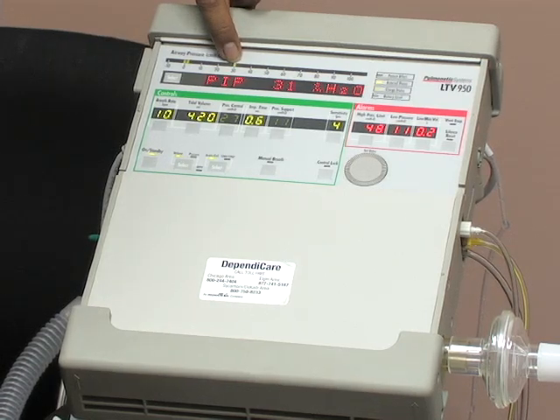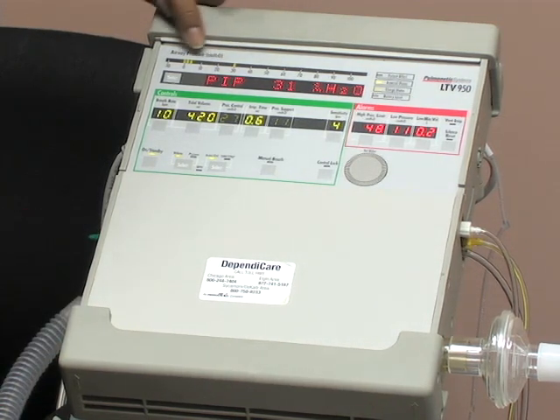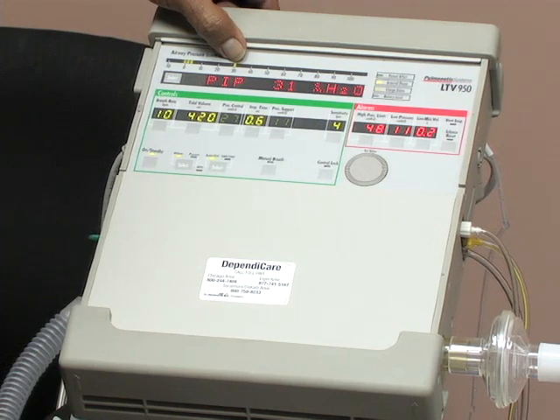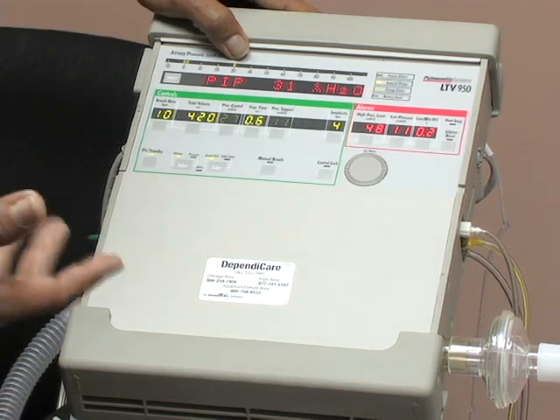As you can see, it says right about 30, and each time, every breath it changes. So whether you're scrolling or not, you can always see what your PIP is, your peak inspiratory pressure, at any moment or on any breath by looking at your graph. It's a very, very useful number. This gives you an indication of the amount of pressure in your client's lung.